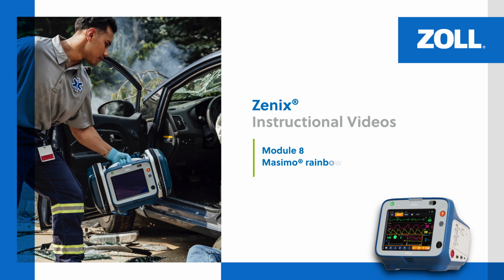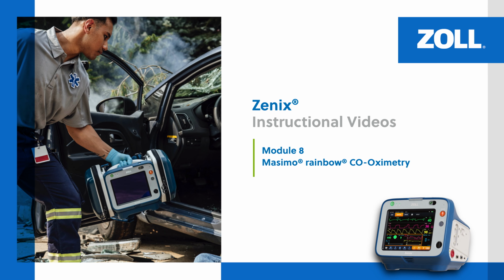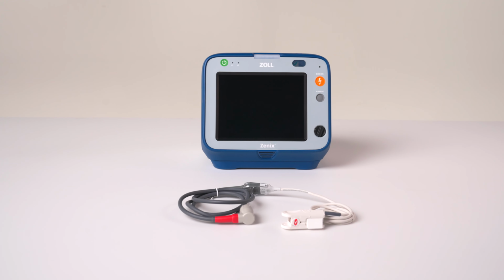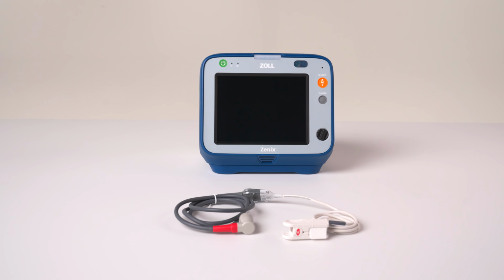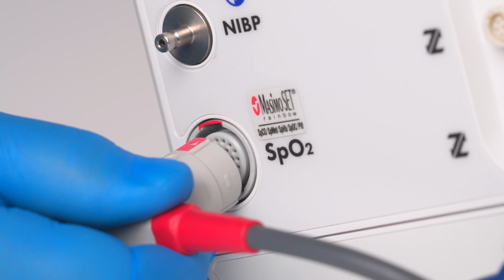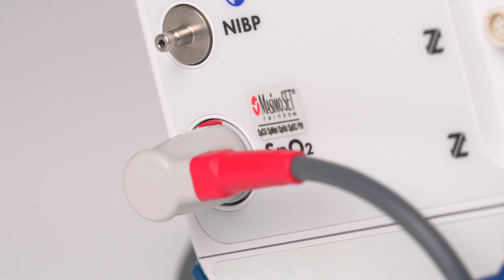In this overview, we will review the pulse oximetry features of the Zenix Monitor Defibrillator. To utilize the Masimo pulse oximetry features, first attach the patient cable to the side of the device. There are red indicators on the cable and the device to ensure it is properly connected.